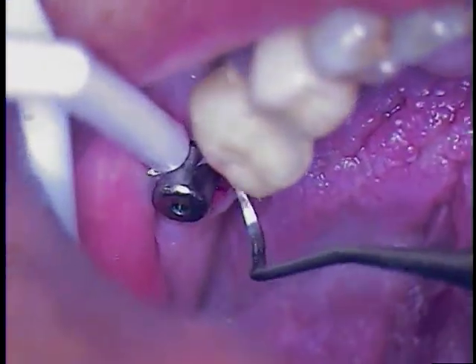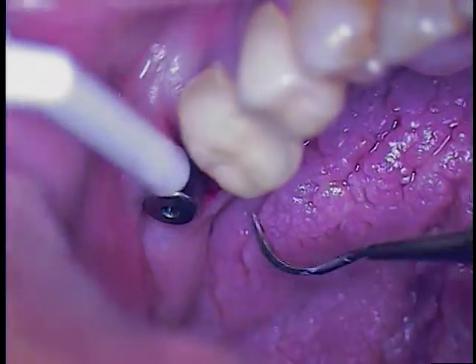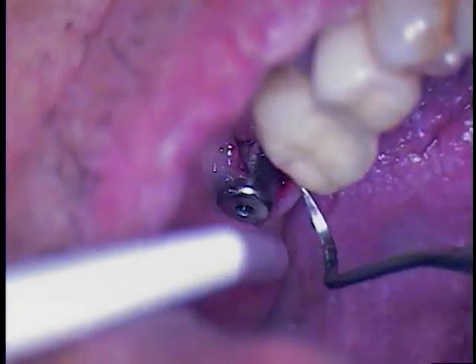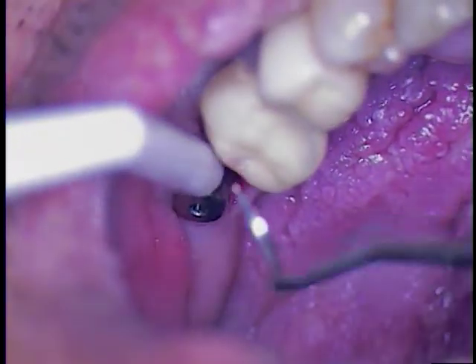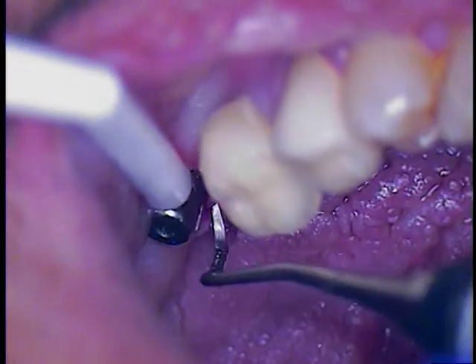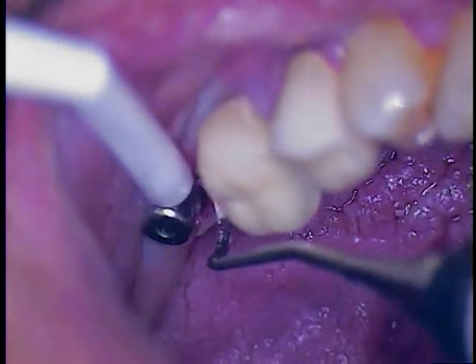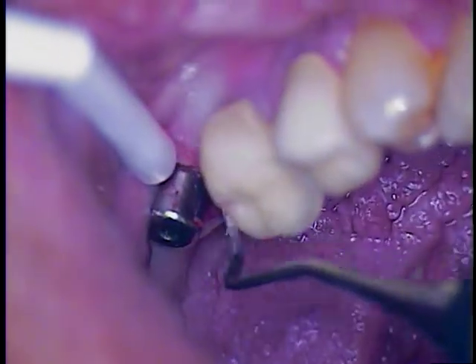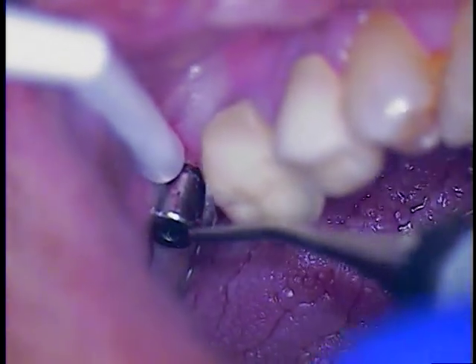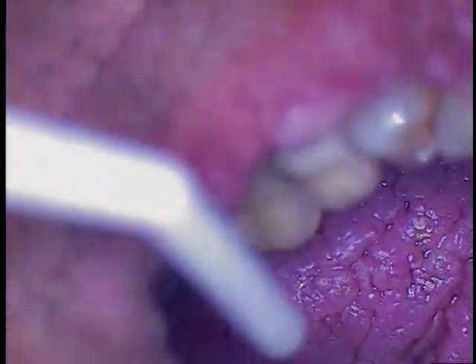I just have a few more tags to get. We've got to use an astringent to coagulate this blood and control it — Astringent X. This is just a little more fibrous on the mesial; I don't want to trap any tags underneath. That doesn't help.